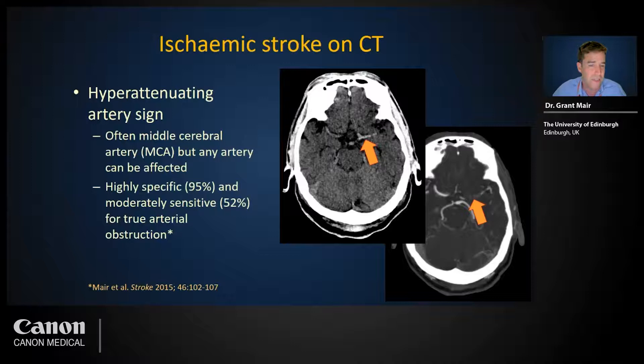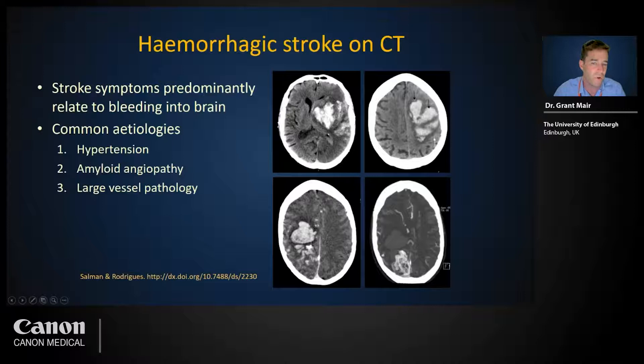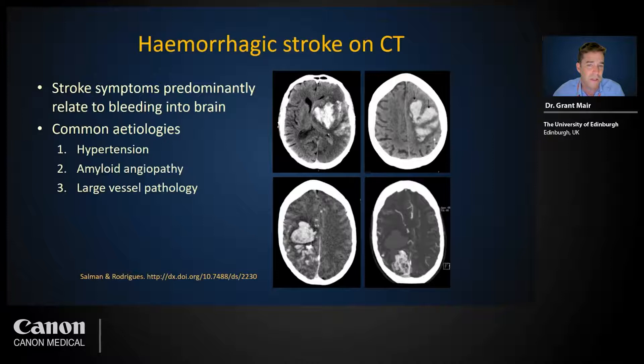Stroke caused by hemorrhage is usually more easily seen in the earliest stages — note the dense or hyper-attenuating blood on these images. There are three common non-traumatic causes of spontaneous bleeding: uncontrolled hypertension, typically causing bleeding into deeper structures such as the basal ganglia or brain stem; amyloid angiopathy, typically causing lobar bleeding with finger-like extensions into the gyri and sulci; and underlying vascular abnormality such as an arteriovenous malformation. Ruptured aneurysms can also be considered here.